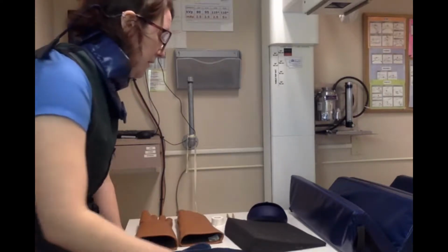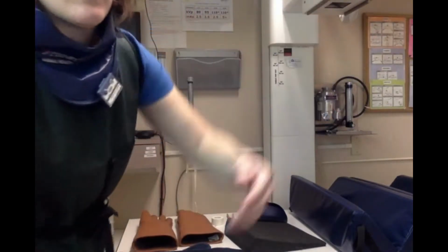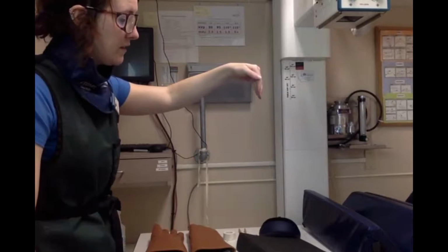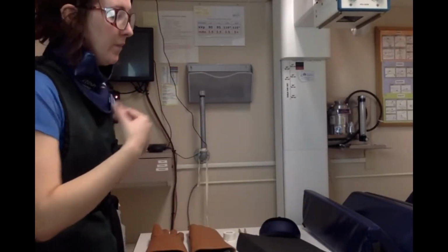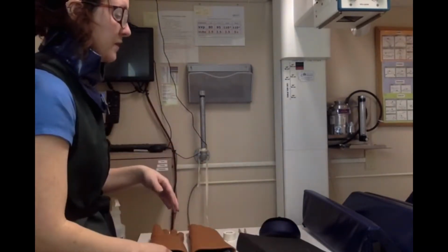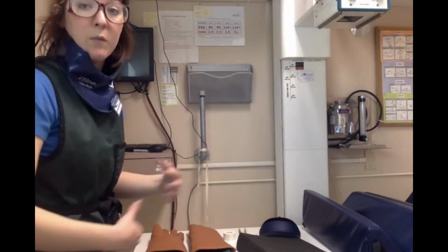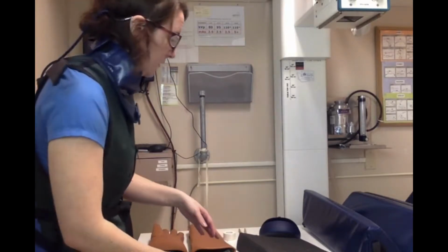But we do our best to keep as far away from the primary beam, which would be coming out right up here, as possible. Because the primary beam is really where all that radiation is coming through, shooting photons and energy down straight into the patient's extremity or body. And then the image receptor picks up everything on the other side, but we want to stay away from that primary dose of radiation because that's what's going to be hitting the cells and possibly knocking any of the double helix formation in our DNA out of alignment.